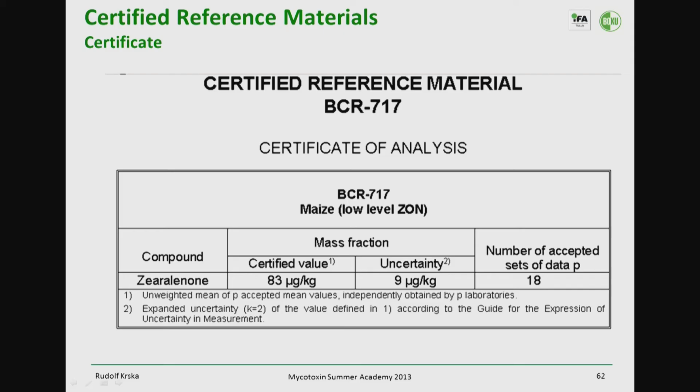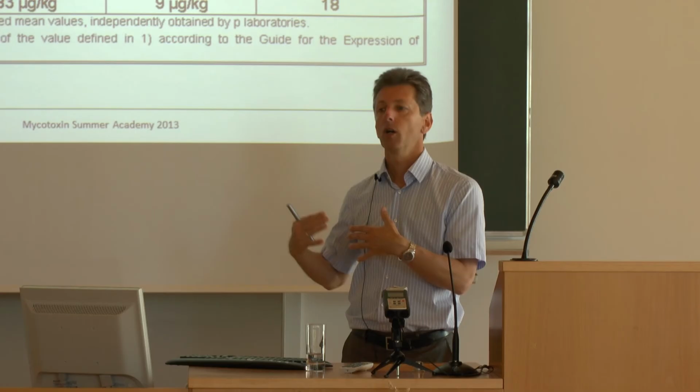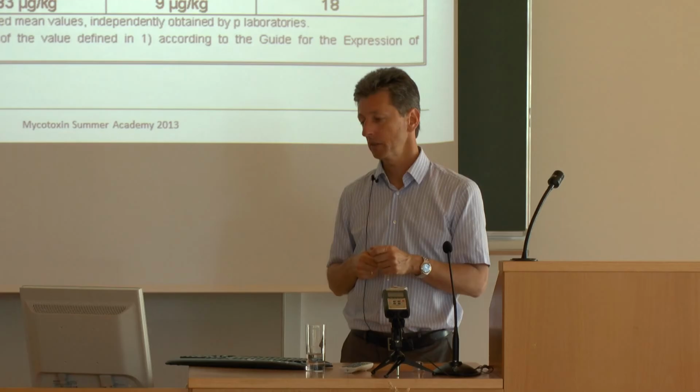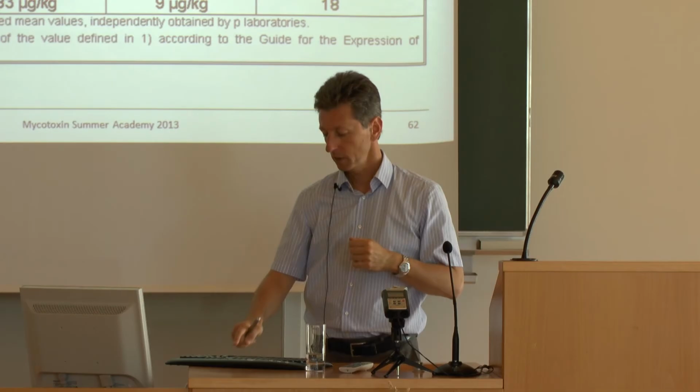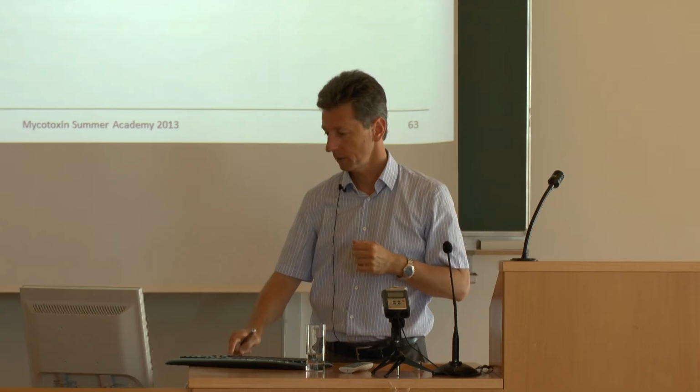But this uncertainty does also take into account, by the way, not only the uncertainty of the measurement, but also the long-term stability of the material, because they want to sell this material also in 10 years from now, and they have to demonstrate the stability, but also, in case of slight instability, what is the contribution of potential instabilities to the uncertainty of this result. For the proper use of certified reference materials, there's a guide provided by IRMM, which I would like to point out might be the best one to use.